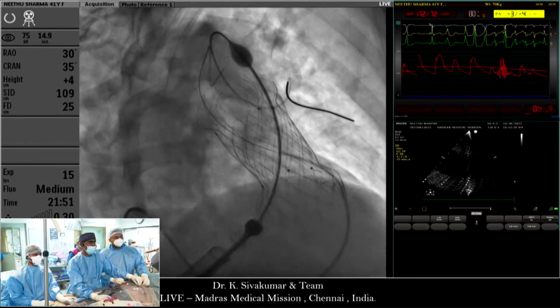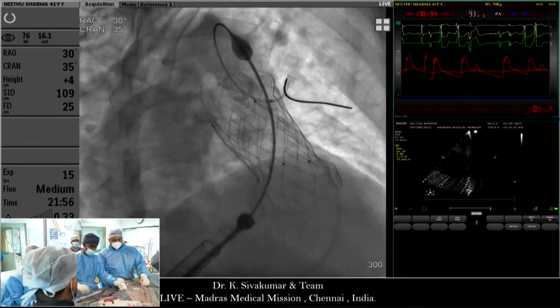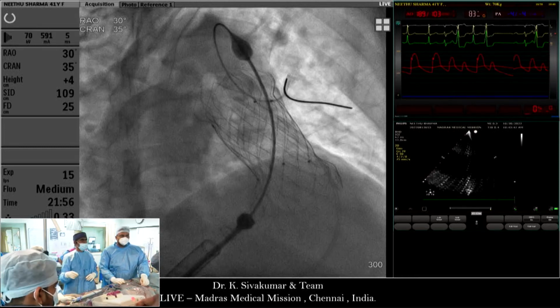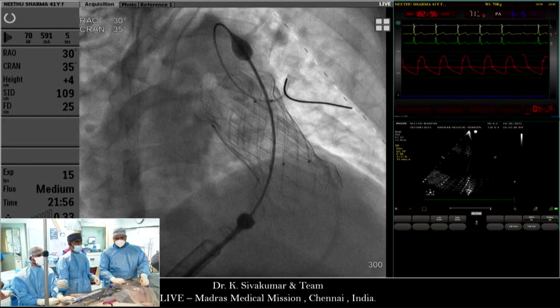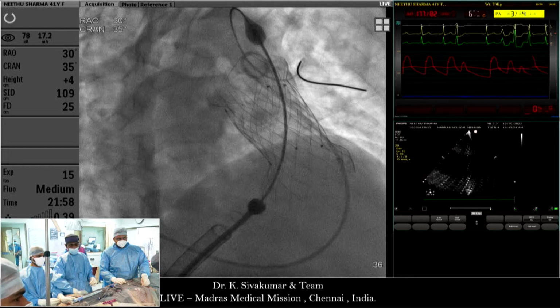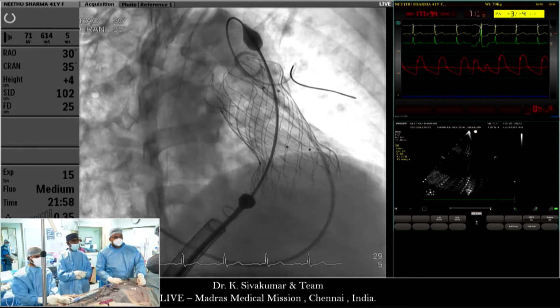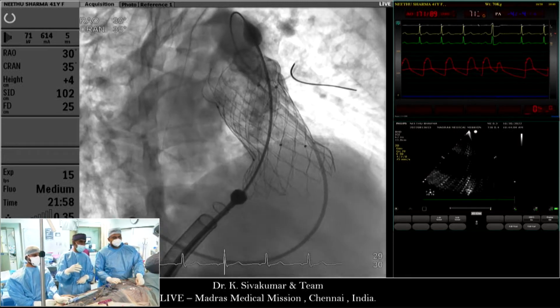Go to the lateral and then you can measure with a pigtail with marker, a calibration pigtail. I'll get you that. Aspirate. My first intention is to ensure that the RPA is fully open. The alignment seems to be okay to me here. We can also see that the two eyes have come out. You are fully open. Ready? Valve is functioning well, and the two eyes are fully released.